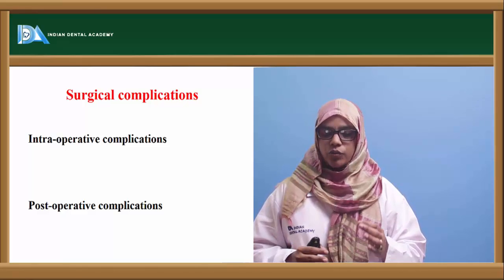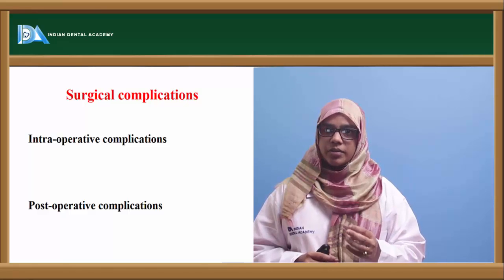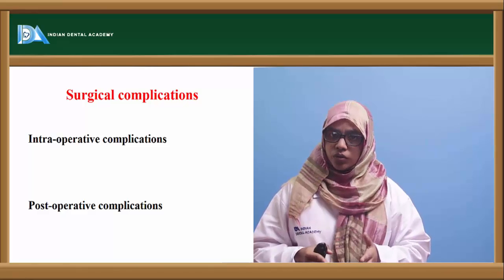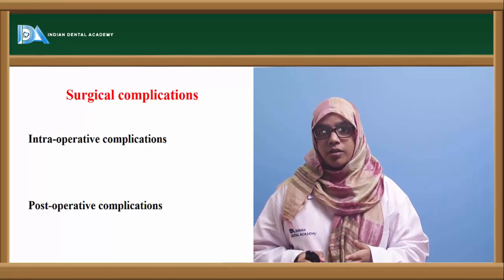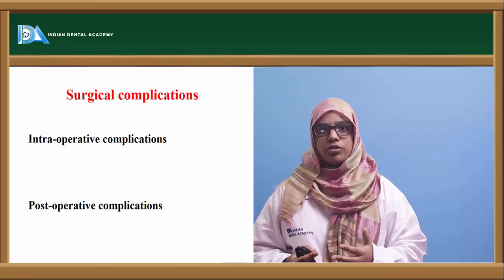Say you have done your osteotomy and you're going to place an implant; sometimes the crestal bone might chip. In that case, rather than doing an osteotomy, you should opt for a ridge split technique, which will not cut the bone but will expand it and preserve the cortical bone on the edges.